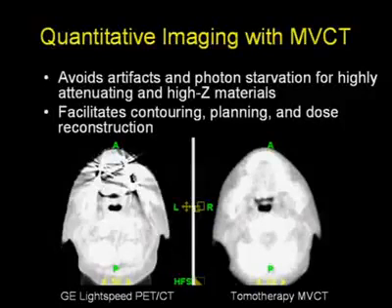And these are examples. I don't think they display very well here for some reason, but the images on MVCT, on cone beam CT, because the X-ray energy is high, most photons interact using Compton interaction, and therefore you lose the K-edge sensitivity, but at the same time you gain the density dependencies on the materials.